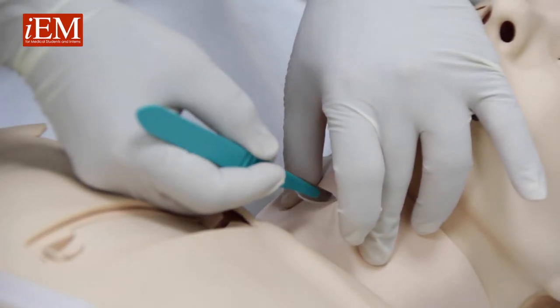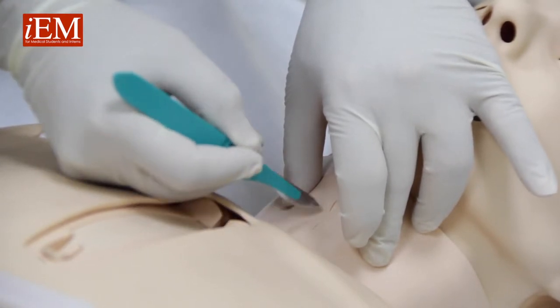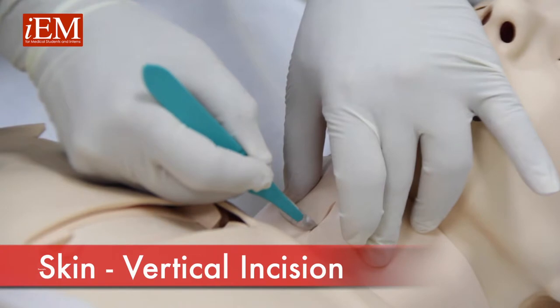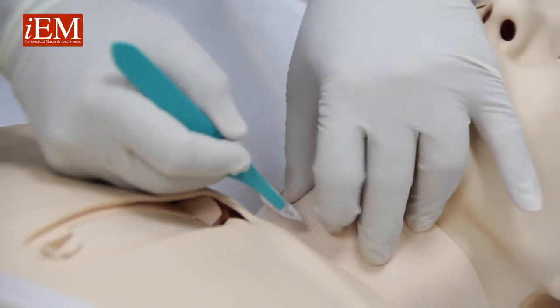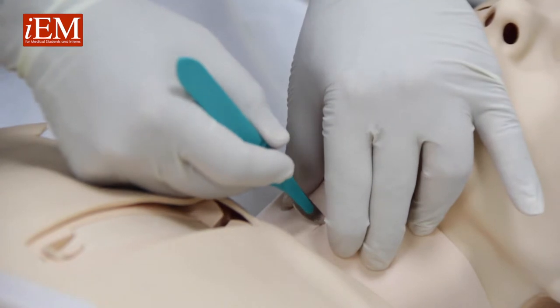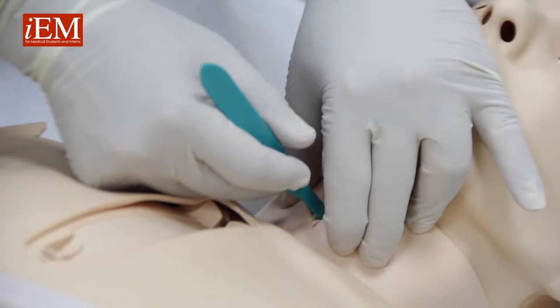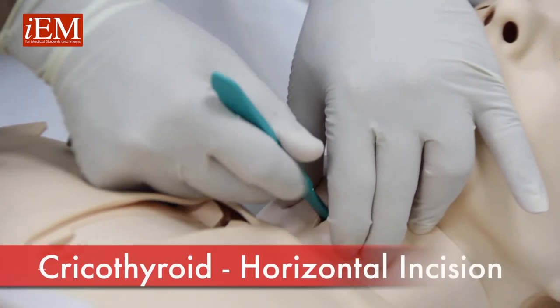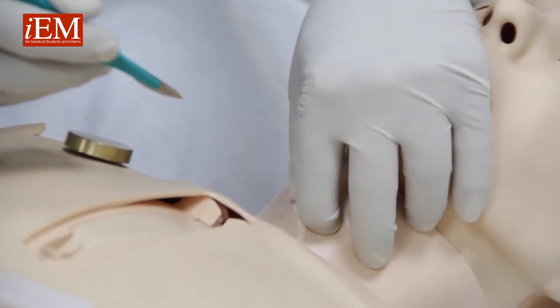You make a vertical incision with your scalpel and locate the area. Once you make this, go straight into your cricothyroid membrane, cut on both ends, and now your finger is inside.